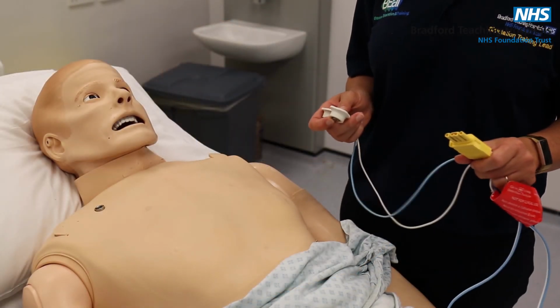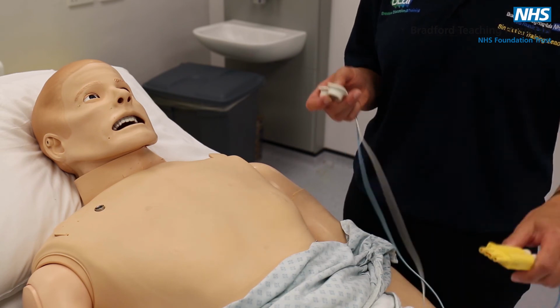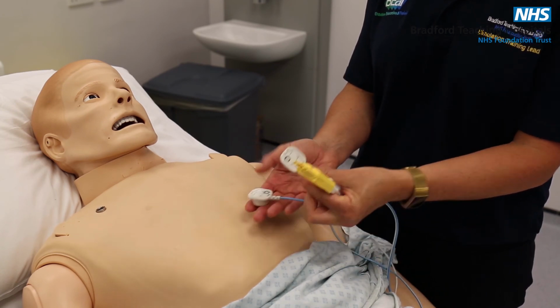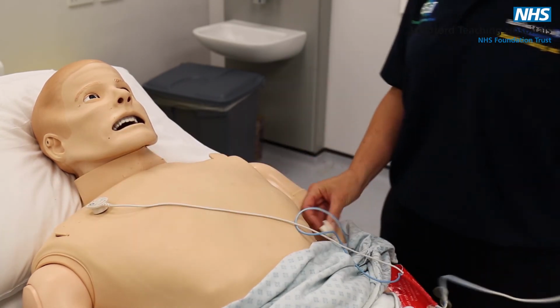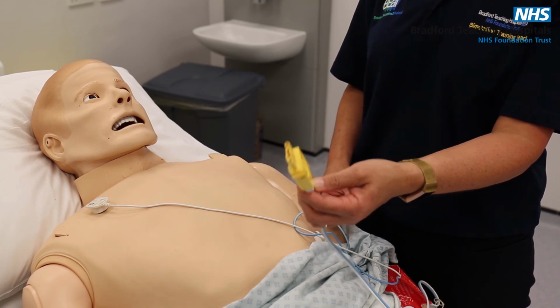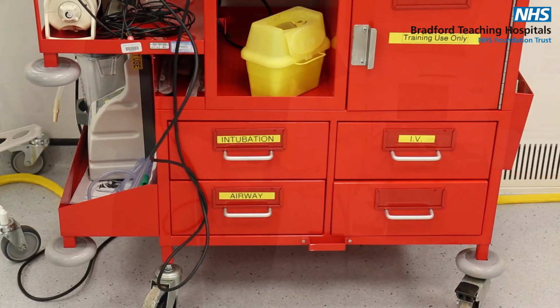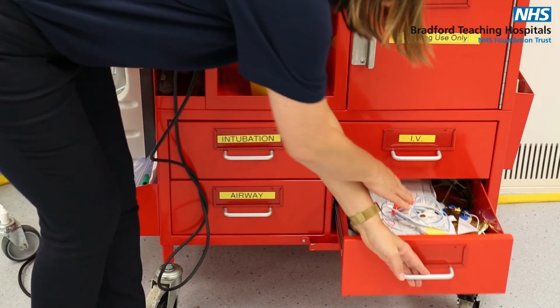So if at any point during your scenario you want to attach your patient to the defib, then instead of using the normal defib sticky pads, Simman has special adaptations. So these are on the crash trolley and they just clip to the press studs on his chest wall with the plug attaching to the defib in the same place as you would the defib pads. So these pads will be kept in the bottom drawer of the resus trolley.